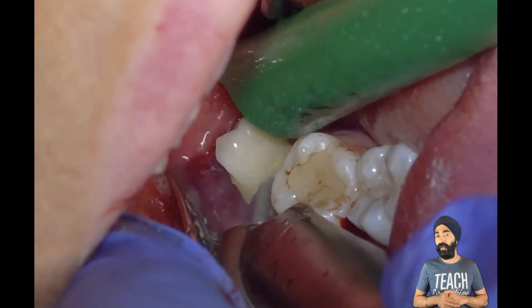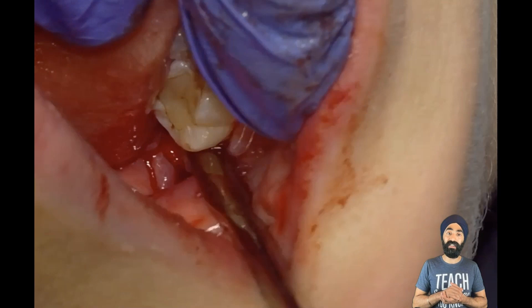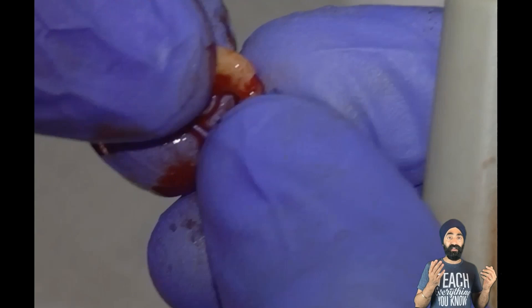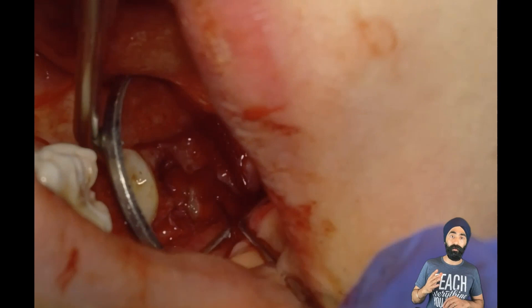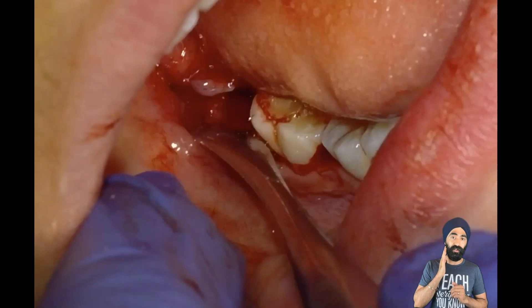I don't want to go all the way through — I just want to get enough. I tell the patient either we get lucky and the whole tooth comes out or more than likely you're going to break the crown. We break the crown as expected, and now the root has a path of exit distally that it didn't have before. We see that lovely little curve there — but where is the distal root? I know it's in there; I can see the pulp space. I took a probe and felt whether it's mobile, checking can I actually get this root out. So I'm going to give the patient a mouth prop because the jaw is getting tired — a really good tip.